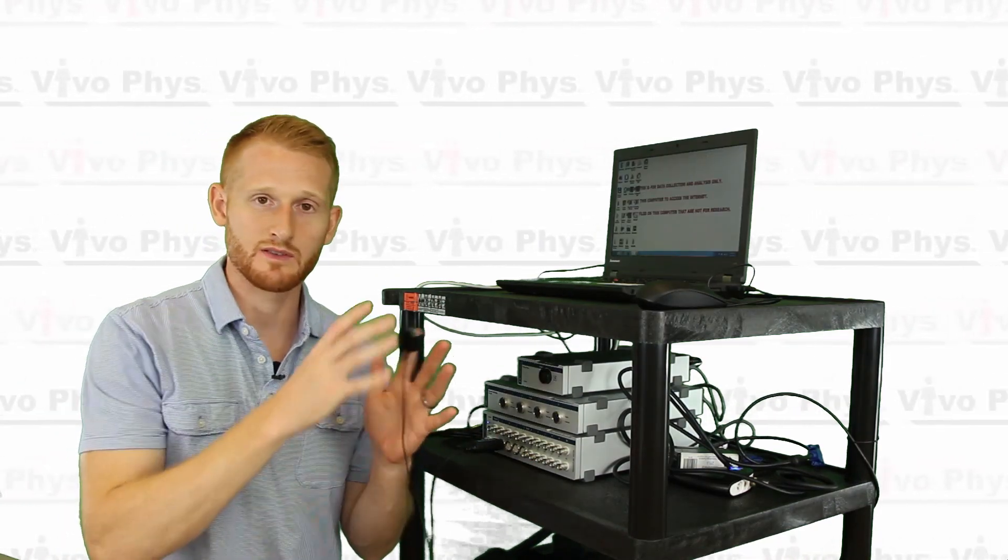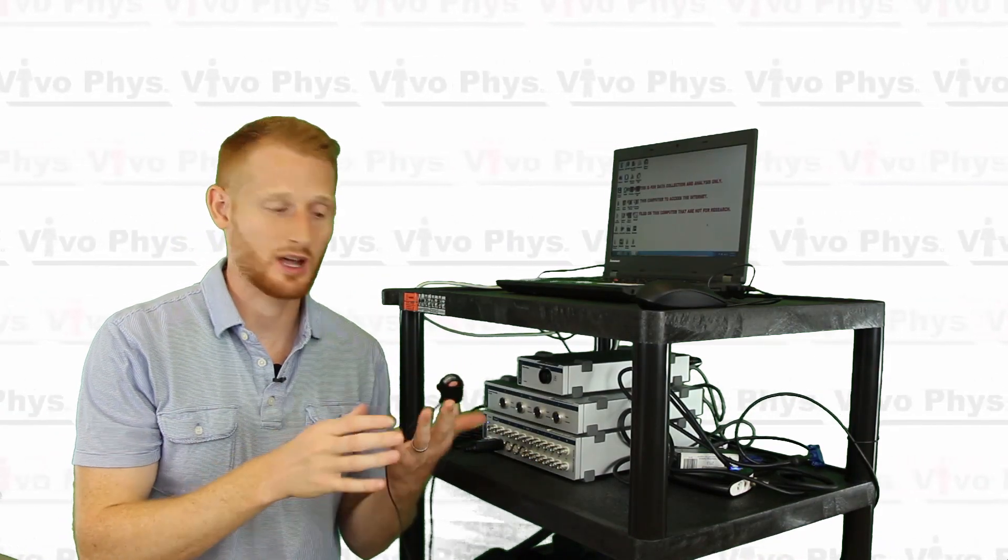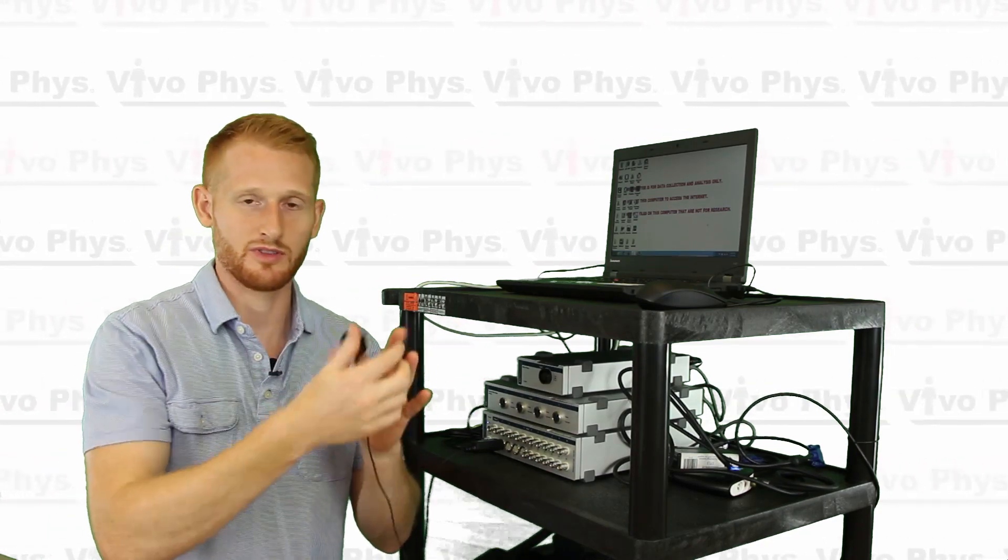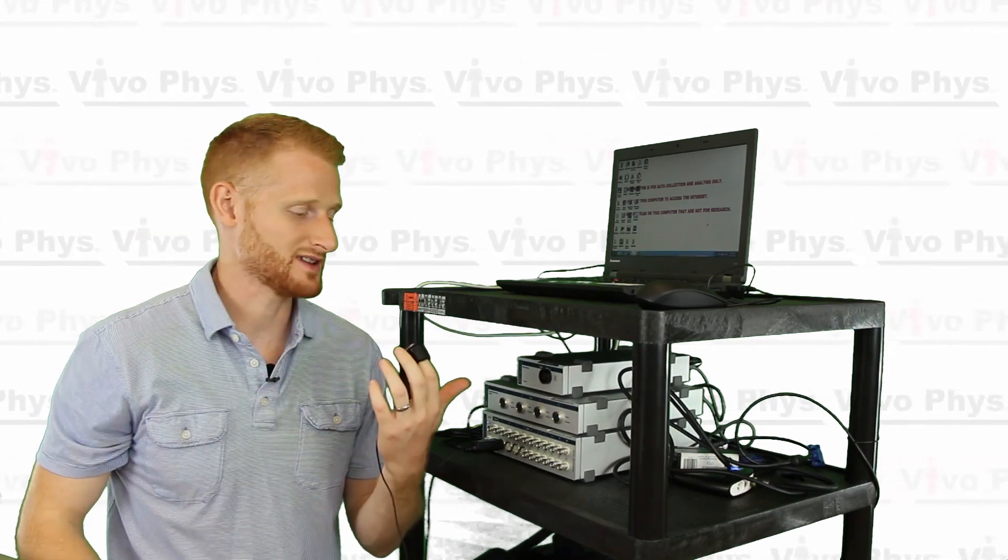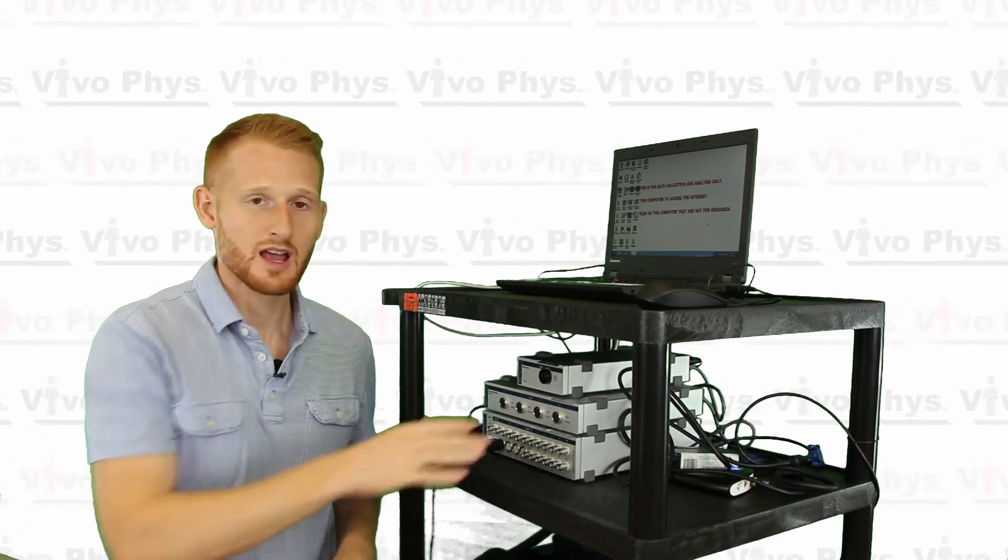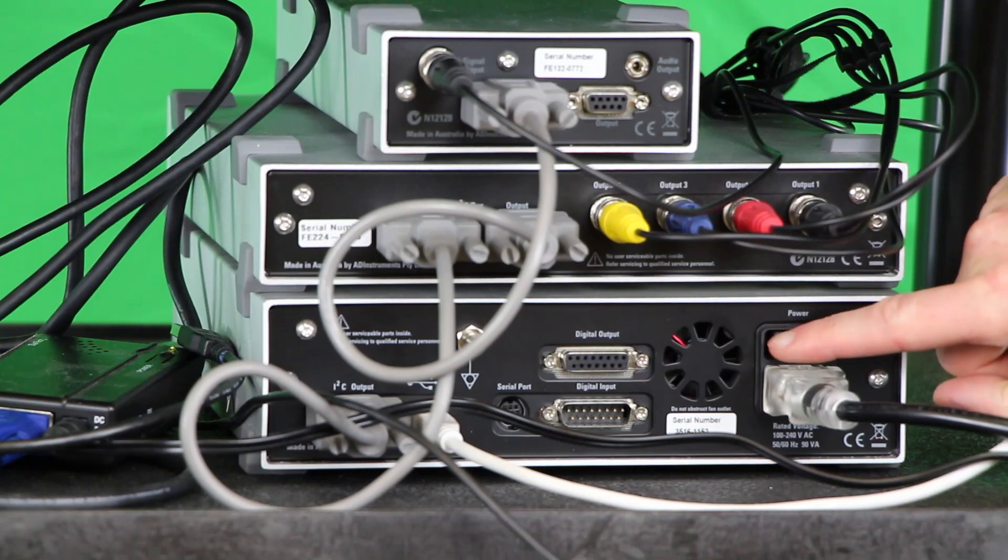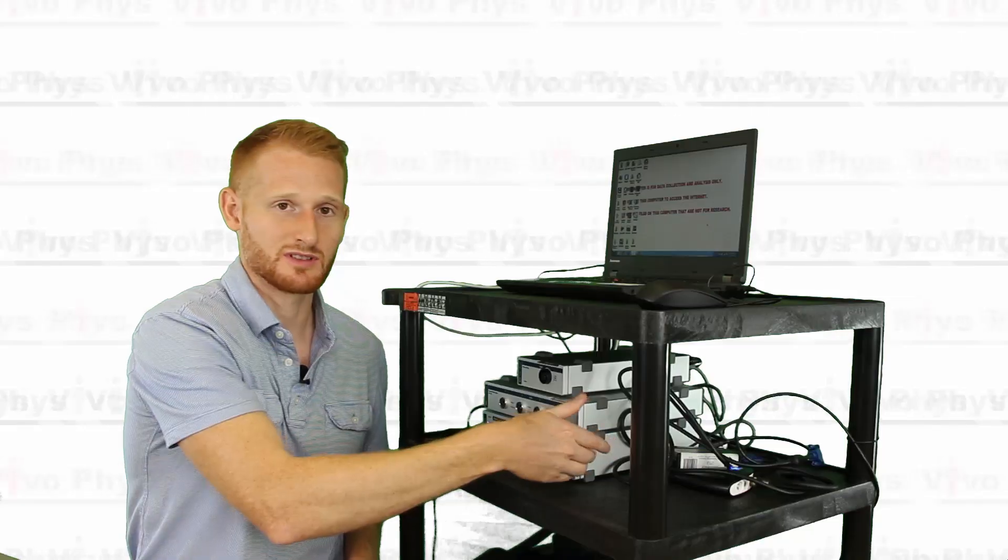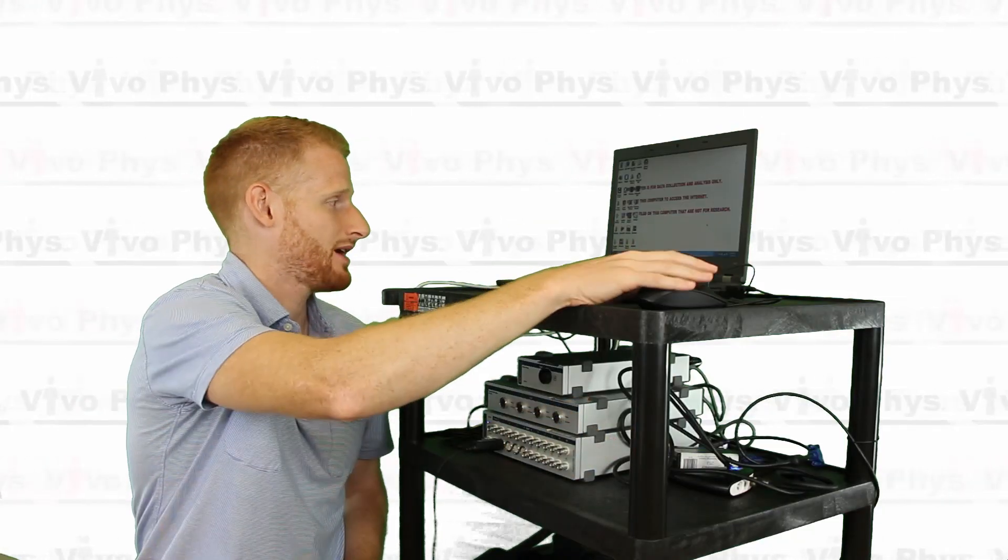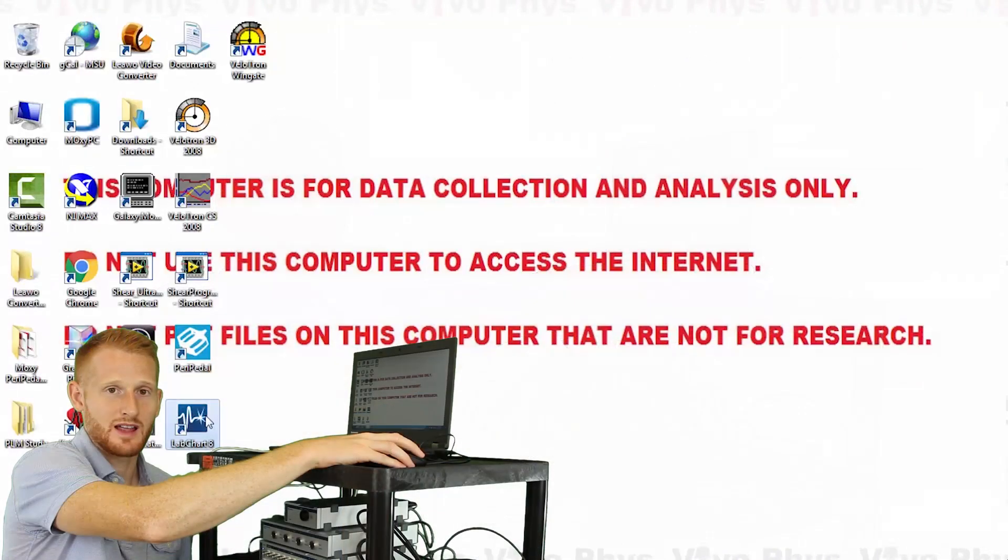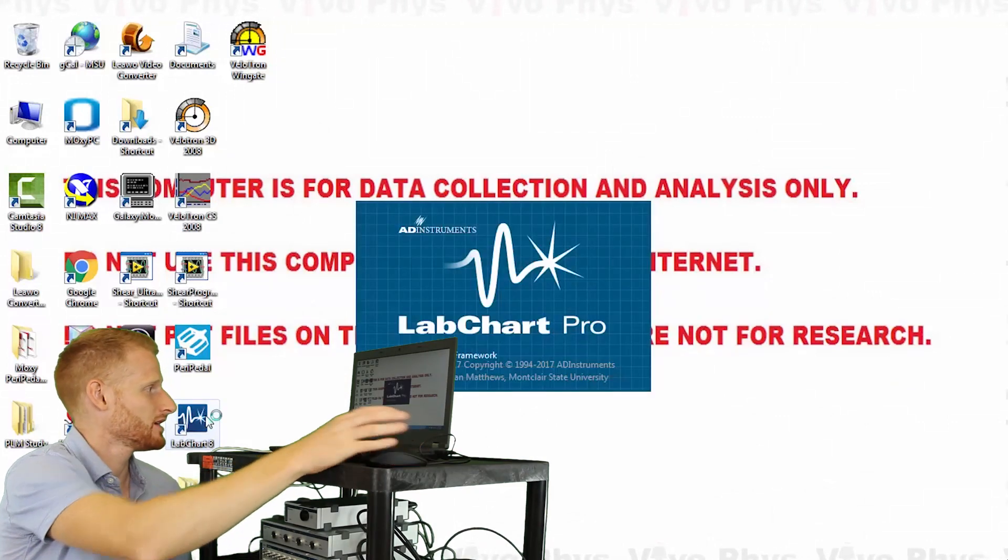Alright, so now that we have everything hooked up and I'm actually connected with the device on my finger, and I have the PowerLab turned on in the back—which is a little green switch in the back—we're going to open up the LabChart 8 software.